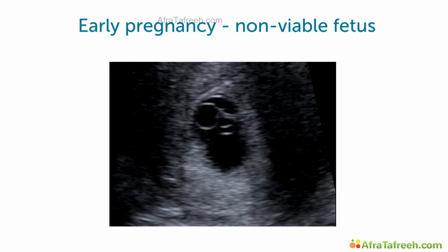Let me show you now an example. This is an image of a 7-week-old baby with, unfortunately, no beating heart. In this example, we see a pregnancy with a gestational age of around 6 weeks. This mother had her first day of her last menstrual period much earlier, so we thought she would be 8 to 9 weeks. This could look as a missed abortion, but we're not sure, because maybe the heart isn't beating yet. So also this exam we want to do again in 7 to 14 days. A missed abortion is a very sad scenario, which causes very emotional stress with the parents-to-be.